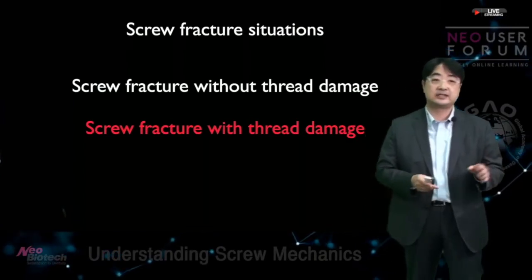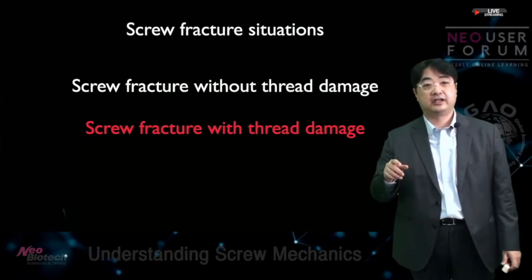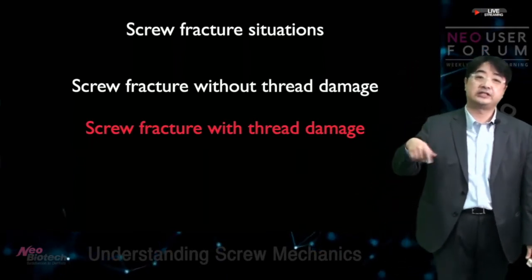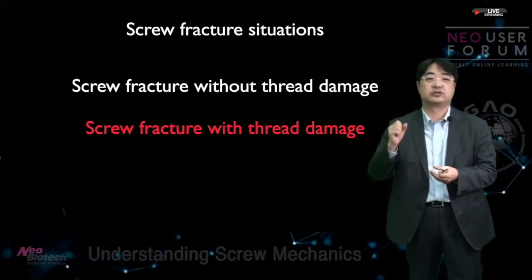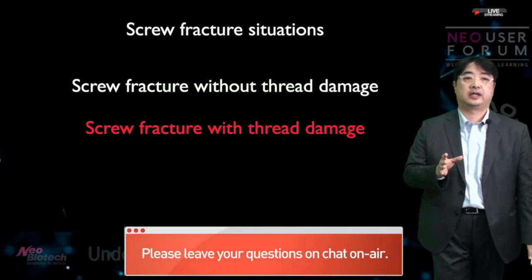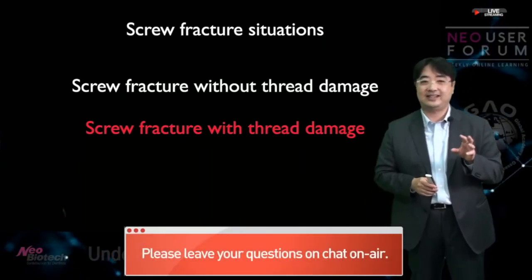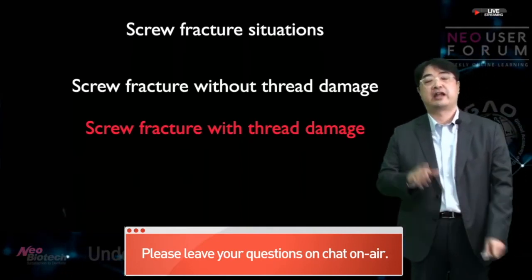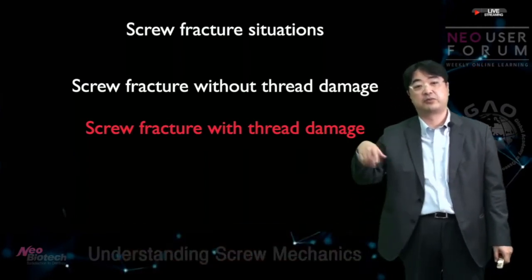It means that with an instrument like an explorer, you can use anticlockwise rotation of the broken screw, and then you can easily retrieve the broken screw from the implant. I'm using the number 125C explorer, a sharp and brand new explorer, and I found it's an easier case where you can use it to retrieve the broken screw.